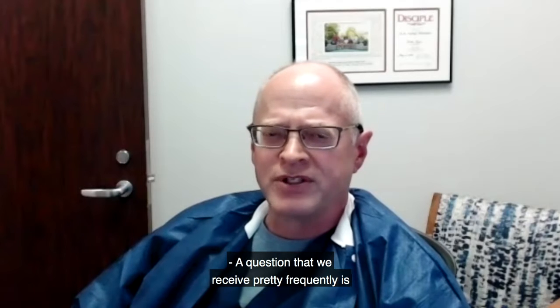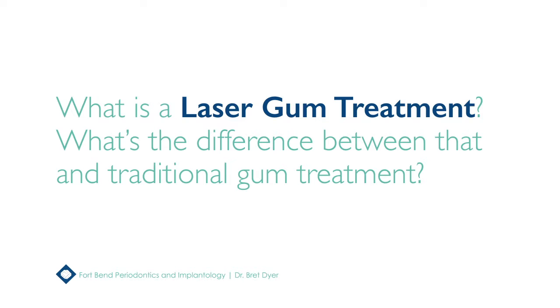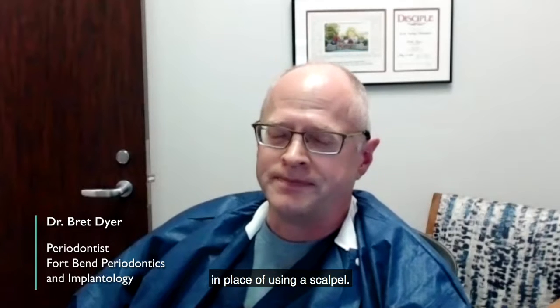A question that we receive pretty frequently is what is laser gum treatment? What's the difference between that and traditional gum treatment? So we use lasers in periodontal therapy in place of using a scalpel.